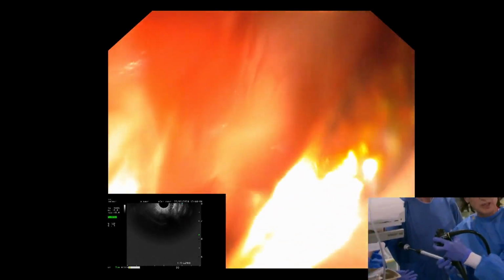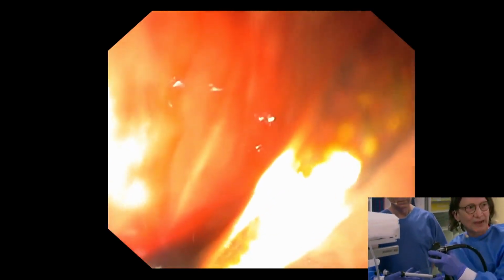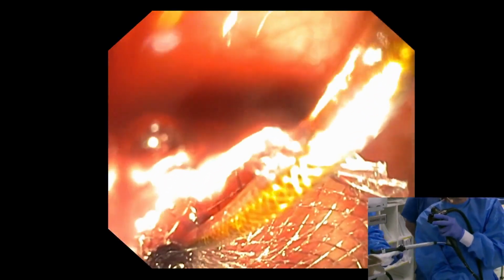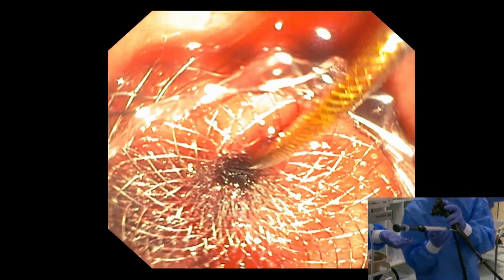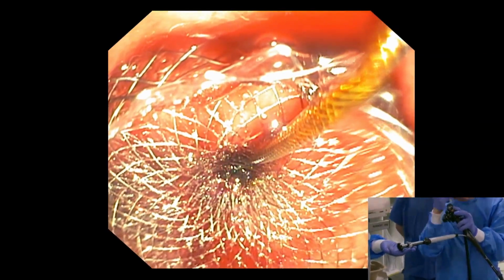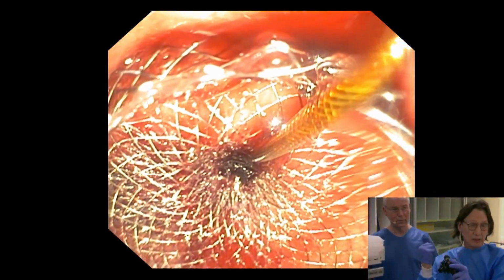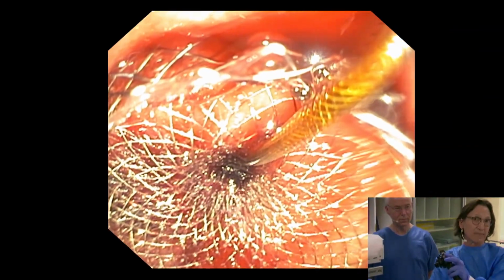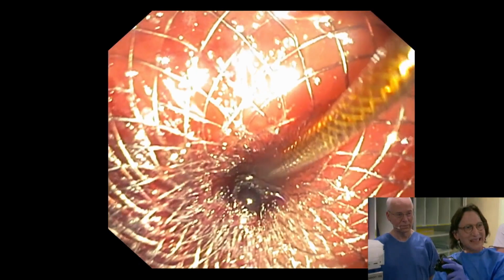Let's take the EUS off. We don't need the EUS now. Okay, so that you can see it. I'm pulling back very slowly. It's always trickier in the bulb. When you do gallbladder drainage, you have to be very careful. And ideally, I want to rotate so I see the lumen, right? See how narrow that is there? So you can understand why if you just yank this out at an angle, you could pull out the LAMS. And that's happened to many, including myself.